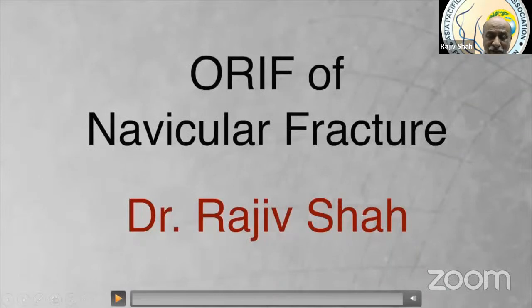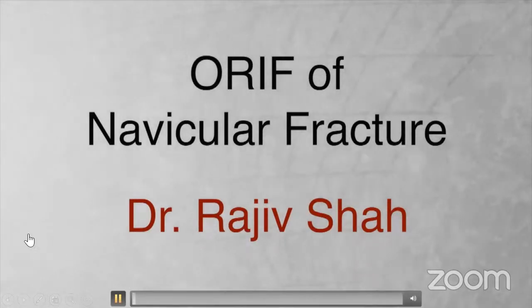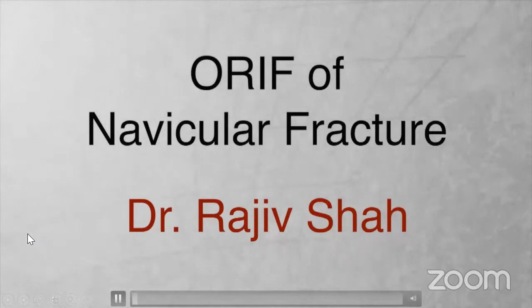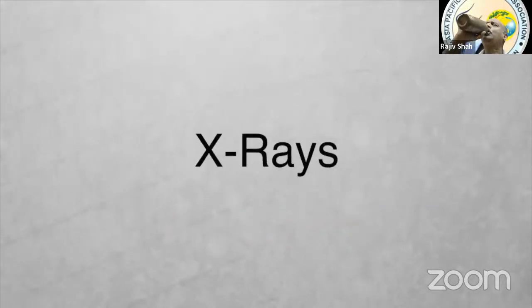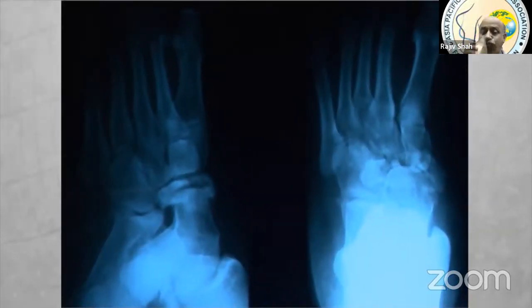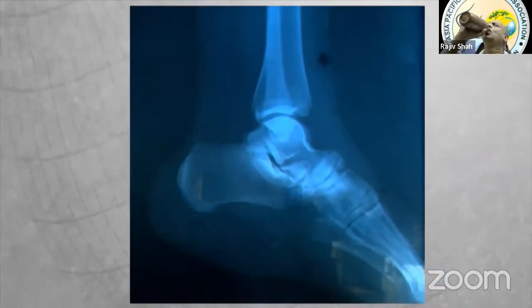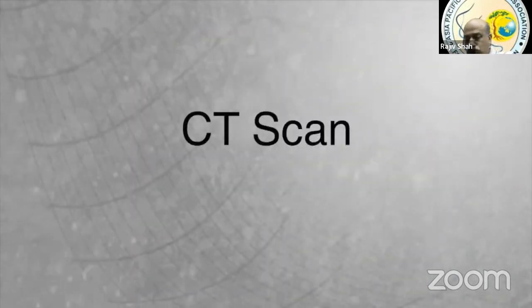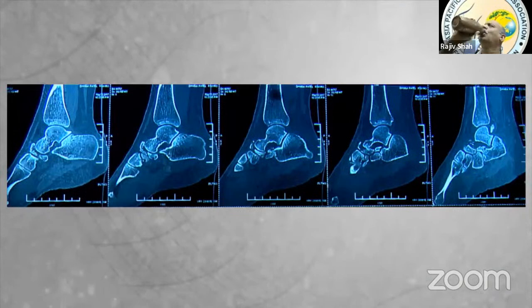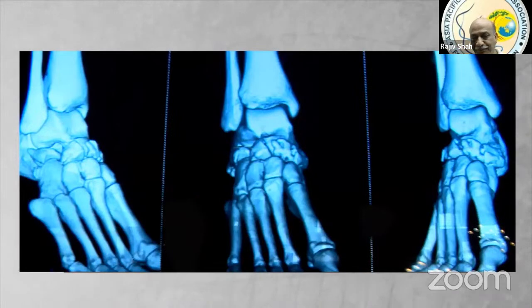I'm starting the video. This video demonstrates open reduction and internal fixation of a fractured navicular in a 30-year-old female who sustained a road traffic accident. X-rays show a comminuted, segmental, displaced, intra-articular fracture of the left navicular. CT scan examination is a must for a midfoot injury to really learn the deformities and displacement of fractures.